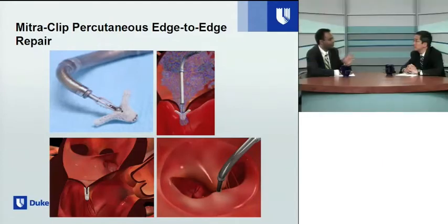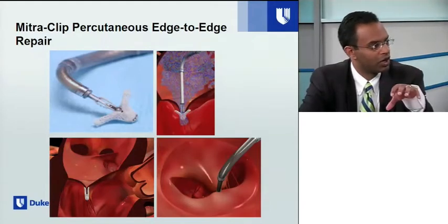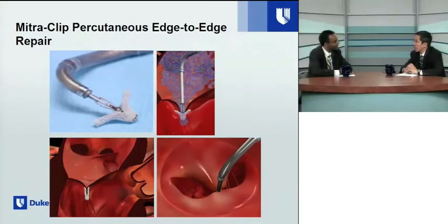Yeah, I have to admit, 3D echo for me was really kind of a gimmick, I guess, but in a situation like this where you really need to understand the relationships of these things, it can be pretty invaluable. Now, because it's a transeptal approach, I guess that might preclude the use of intracardiac echo, which is often also entered via the vein. Is that fair? Yes, this is a fairly large device going in through the venous system.